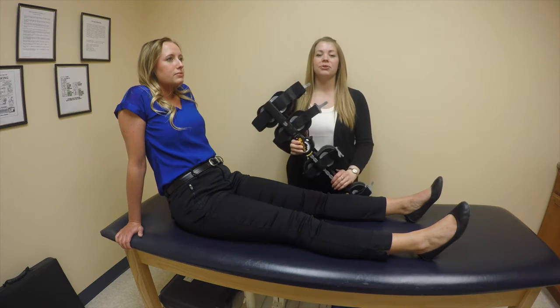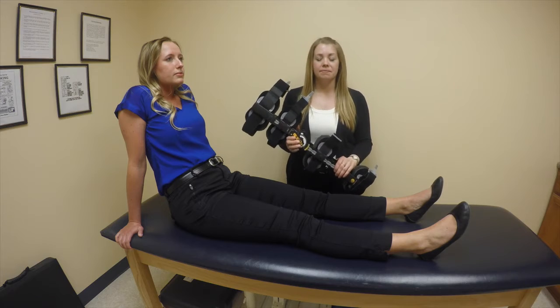My name is Diana. I'm a clinical fitter with OrthoCare Medical Equipment. Welcome to today's video. In today's video, we're going to review the Contender Post-Op Knee Brace.